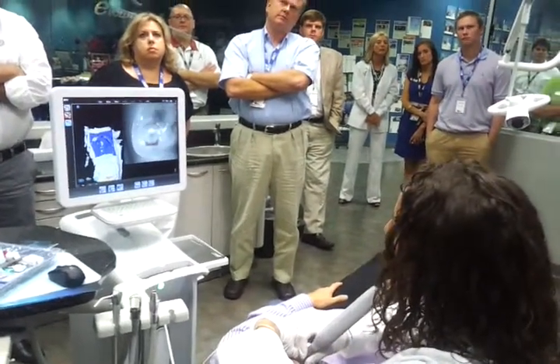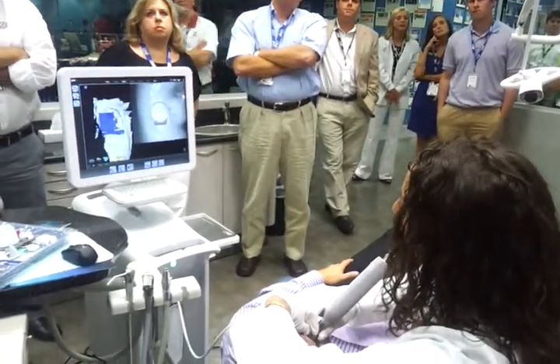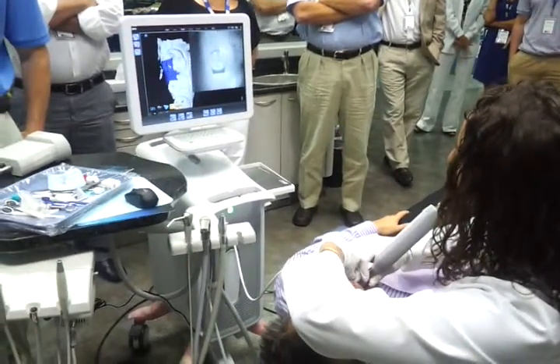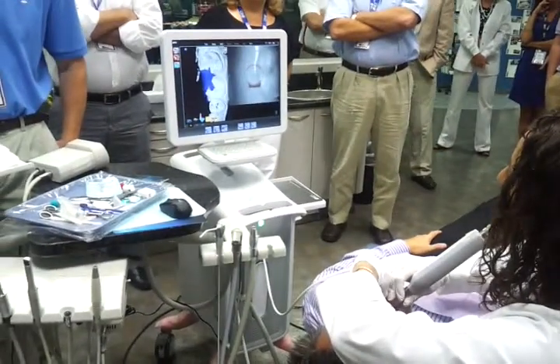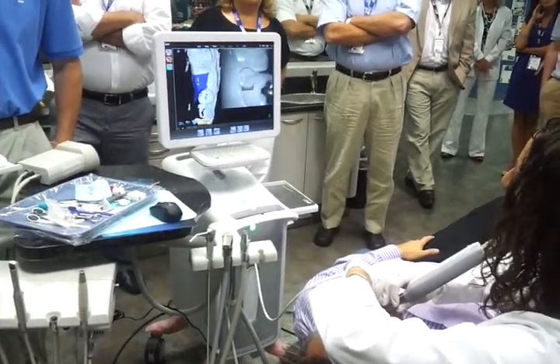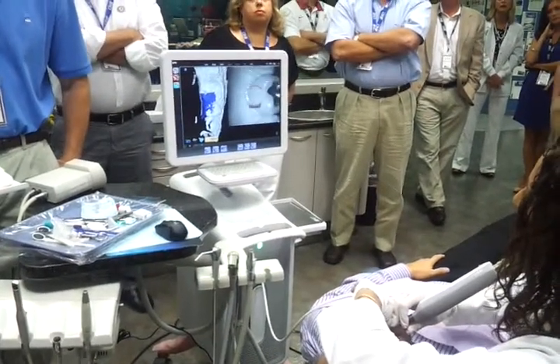So if you look up at the top screen where that blue is, I go back to my last blue scan and I continue my overlapping. So now I'm doing my lingual rotations here and moving back mesial. So I've done that full circle, capturing the full contour of my preparations as well as my neighbors. And again, I have those neighbors, so I have anatomical dentition to match up my bite scans to my prep scans.